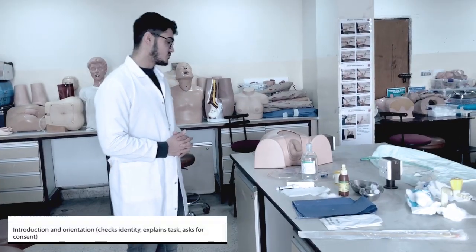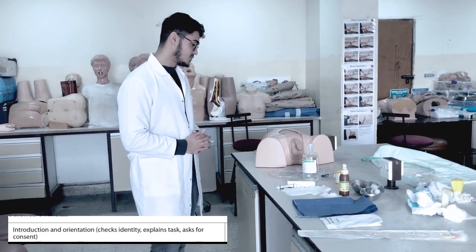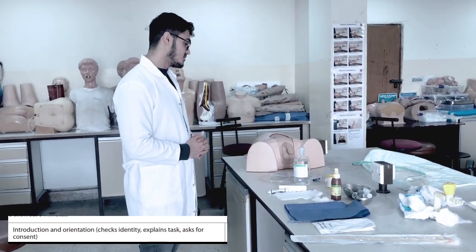CUT module male catheterization. Hello, my name is Mohamed. I'm a Fergur Milka student. Now I'm going to insert the catheter inside your penis.